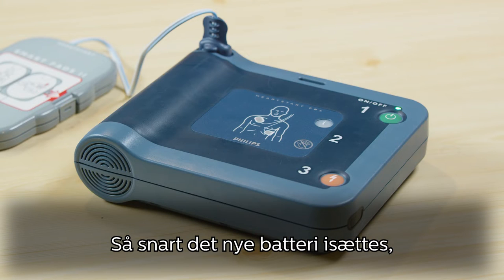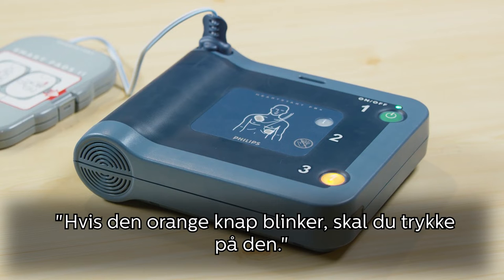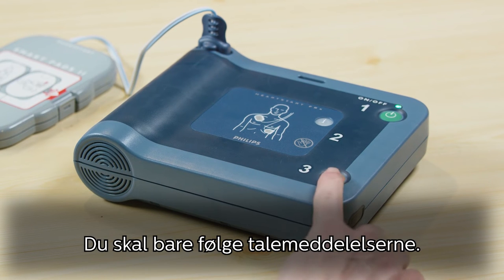As soon as your new battery is inserted, your defibrillator will automatically begin a comprehensive self-test. If the orange button is flashing, press it and simply follow the verbal instructions.